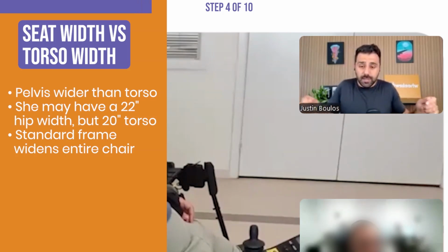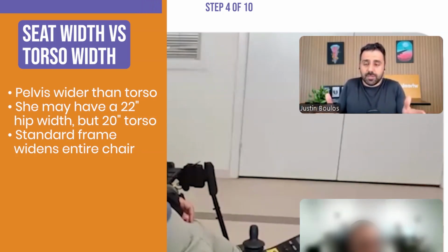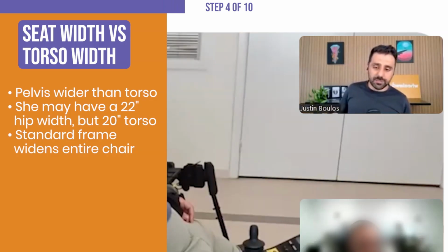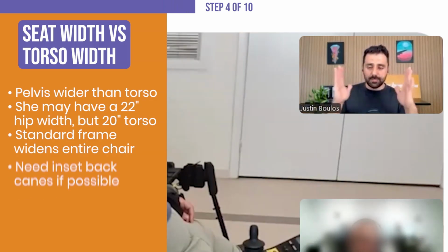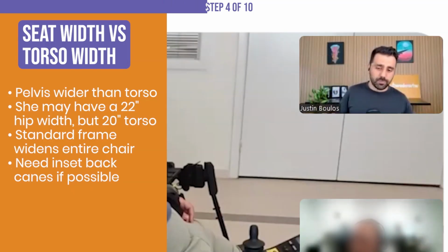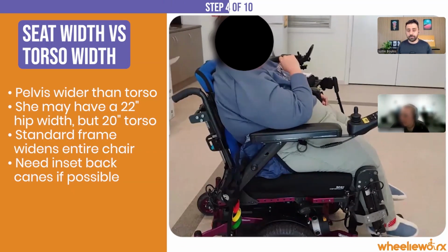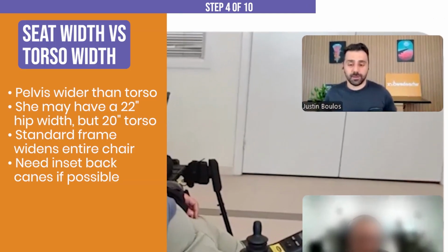So ideally we want the armrest and the backrest tucked in at 20 and allow for 22 at the base. How they do that on a Glide Centro, I'm not sure. I think you can get inset back canes, but I don't know if you can do it with power recline. That's when you can explore other chairs that did that, talk to us about inset back canes potentially. Because that was then in the trial chairs. Obviously, they're not sometimes that specific. Yeah, we're going way out here for the controller. So as long as it's possible, I don't mind how they do it.